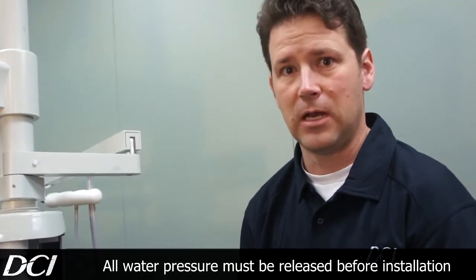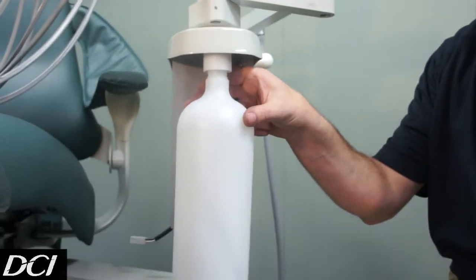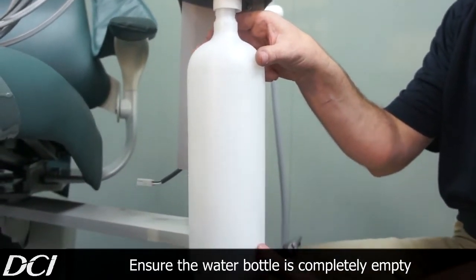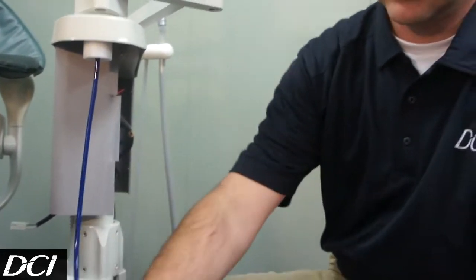Now we're ready to take the bottle off. Go ahead and start unscrewing the bottle until it's ready to drop. In our case, this one's already empty. It's going to come off — we're just going to go ahead and set that aside for a moment.